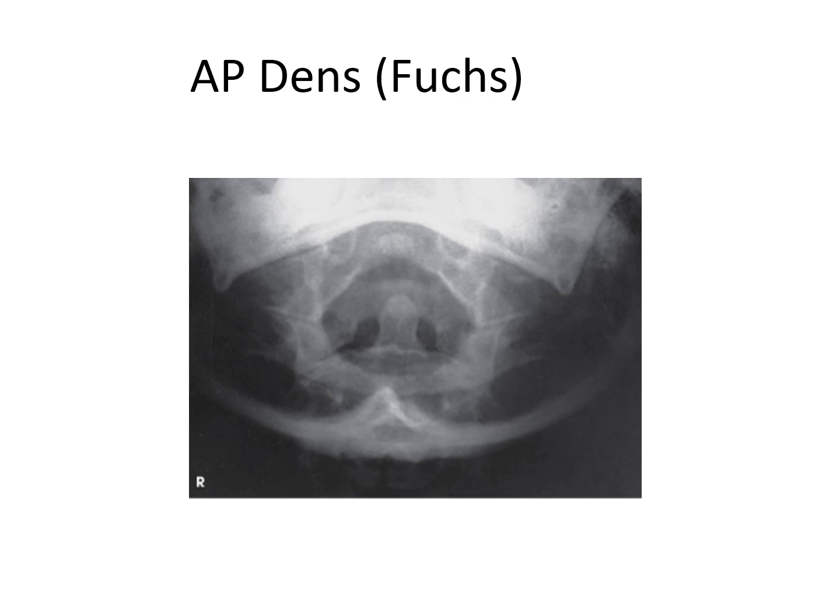Now, I just got done telling you you can't do this if there is a fracture. So I've never seen a Fuchs method that was positive. That's because we don't do this one unless we're absolutely certain that the cervical vertebrae are not fractured, because it does involve a radical extension of the head.